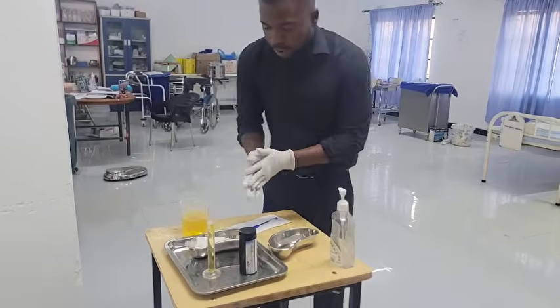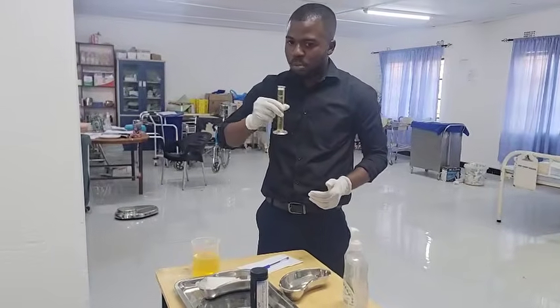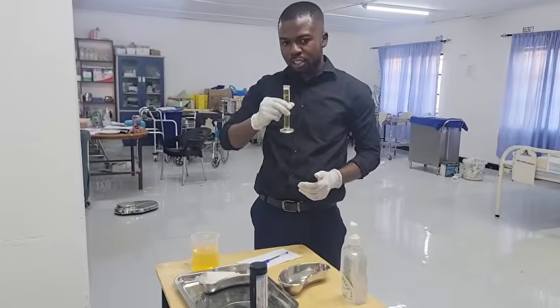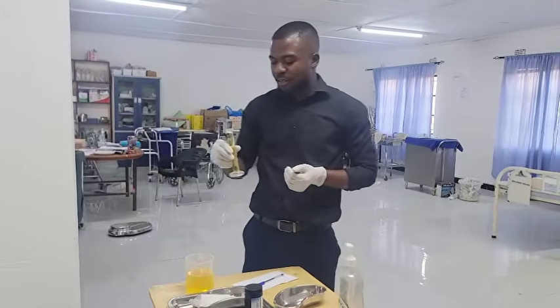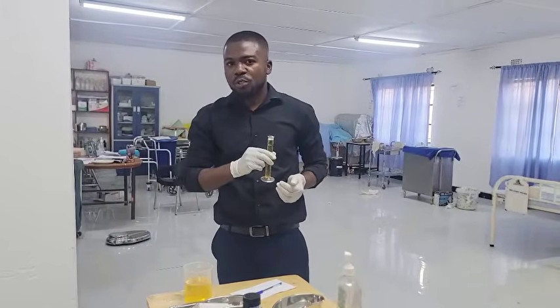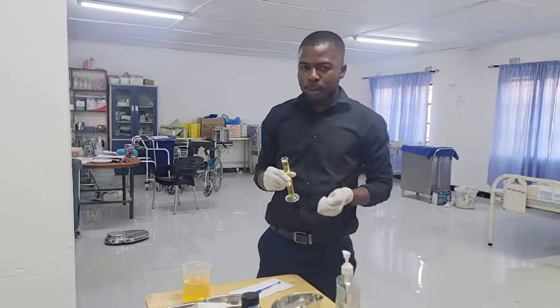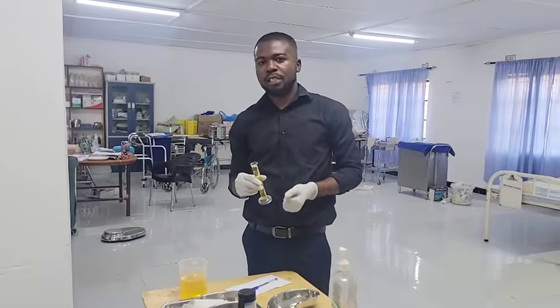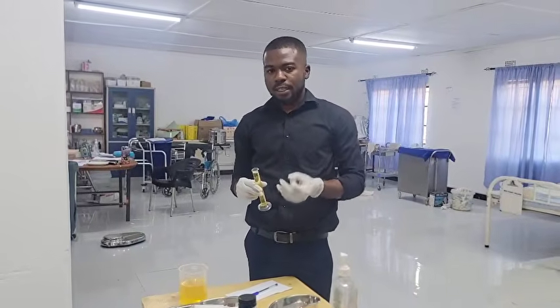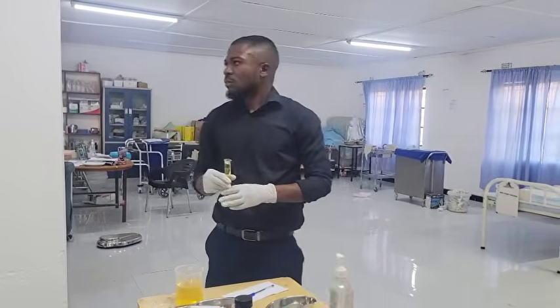After you do that, you lift it and smell the urine. Of course, don't bring it too close to your mouth. Remember, you are dealing with urine. For the smell, you say, my examiner, the smell is aromatic. That's the third property under the physical properties.